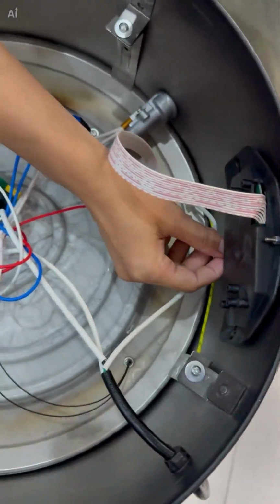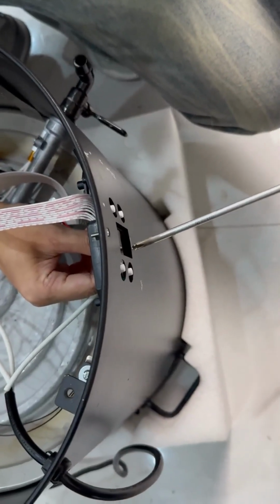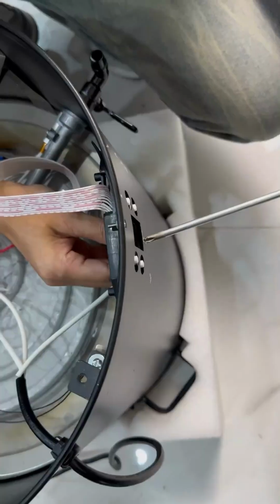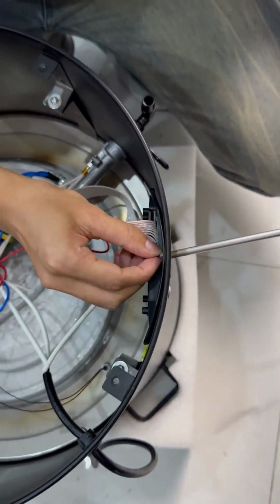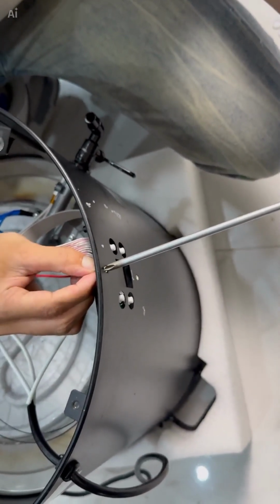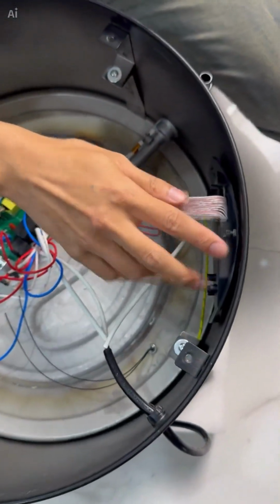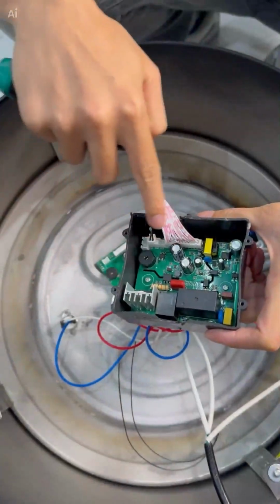It's the same below. Pay attention here. The screws need to be tightened a bit more here. Okay, we have completed a part replacement on this display panel.